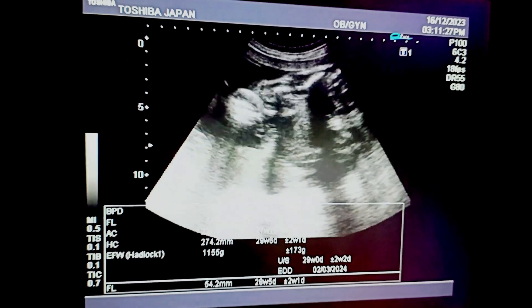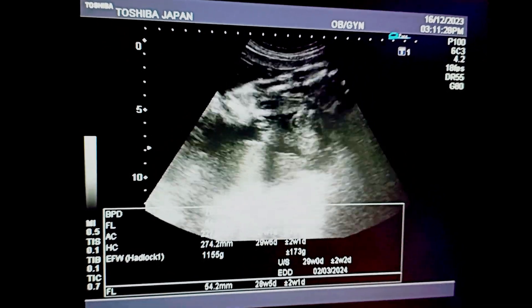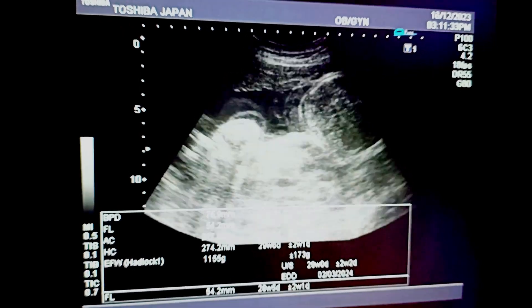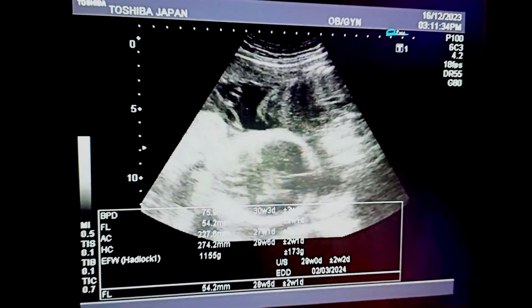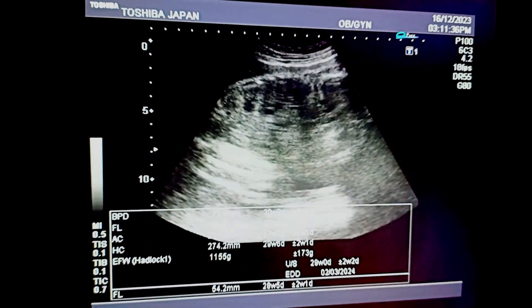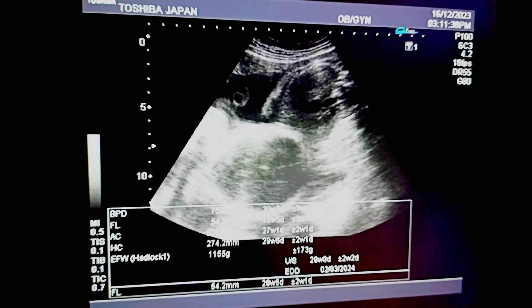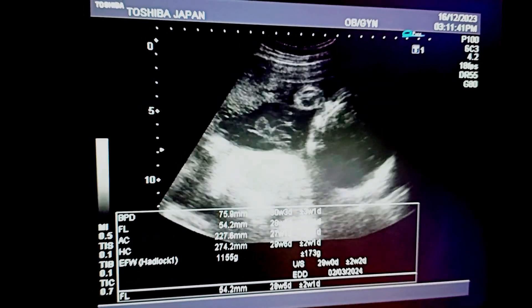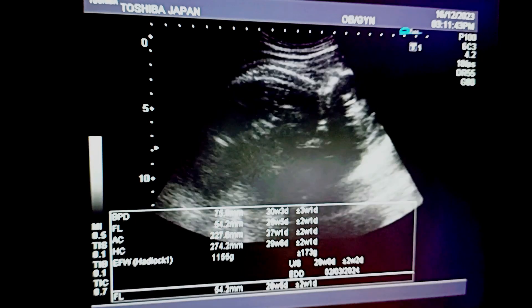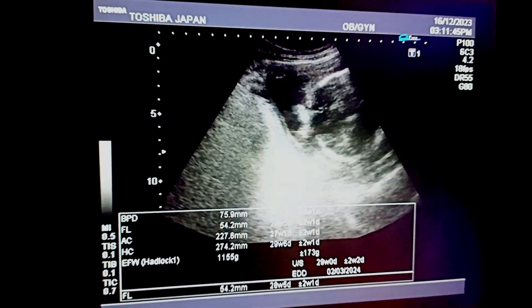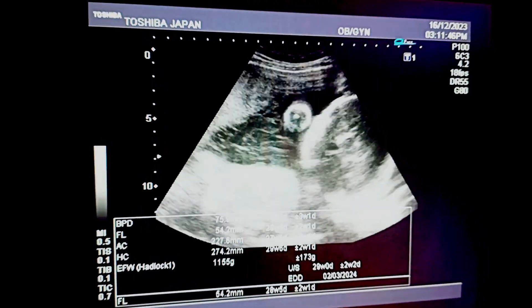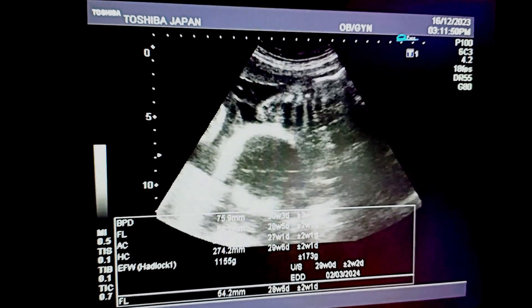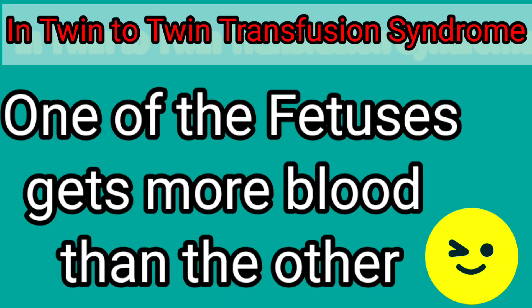You can also appreciate the bilobed placenta — that is, the placenta having anterior and posterior lobes. The liquor within the pregnancy appears to be normal. One common finding in twin pregnancy is multiple fetal parts visible on ultrasound.